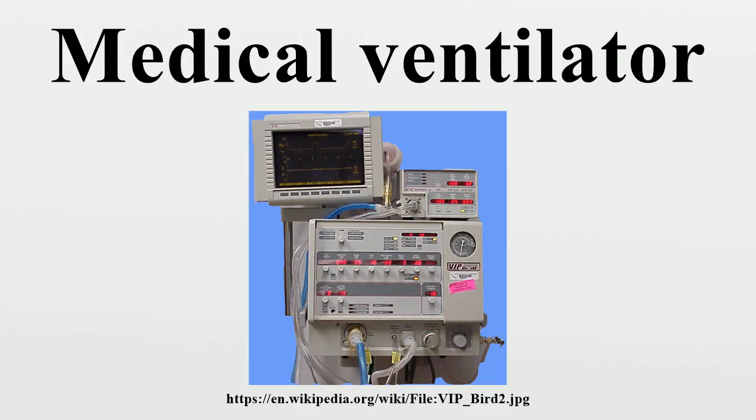In 1999, the LTV series was introduced into the market. The new ventilator was significantly smaller than the ventilators of that time, weighing 14 pounds and around the size of a laptop computer.